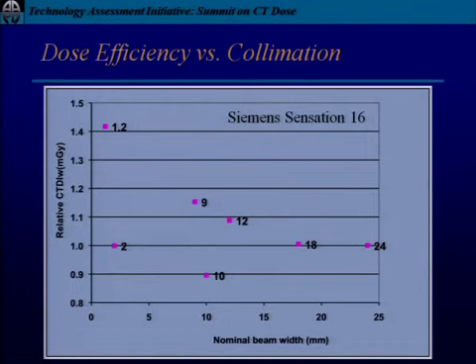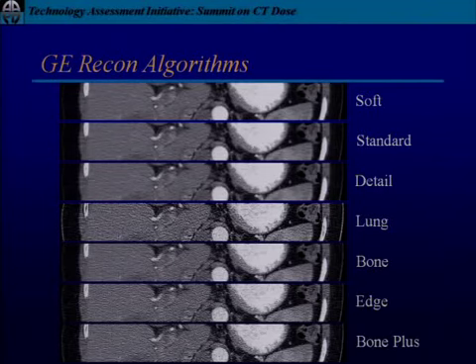These things aren't really obvious. We learned them the hard way. So if someone else thought they were obvious, then my congratulations. But this is why we need more transparent performance data. Where you can get this, in this case, is the CTDIvol. So if you're watching that parameter, it will tell you these characteristics.